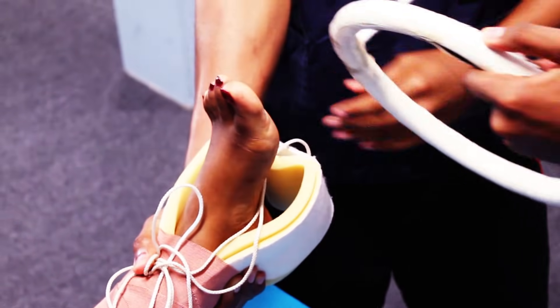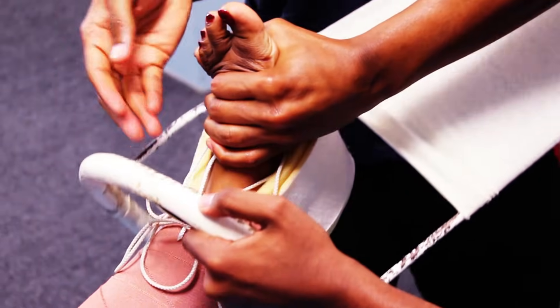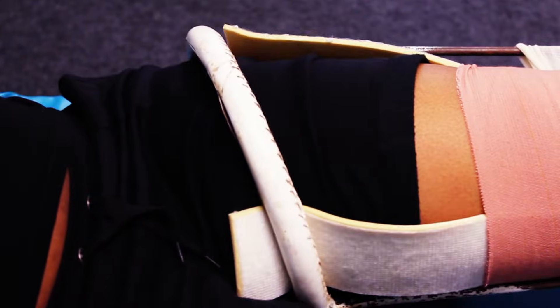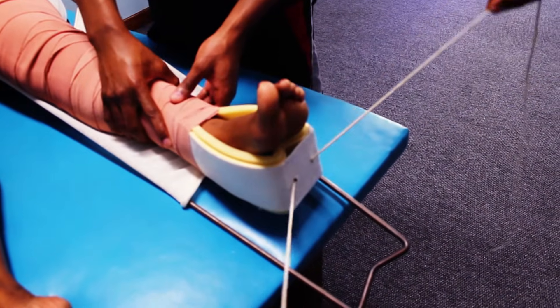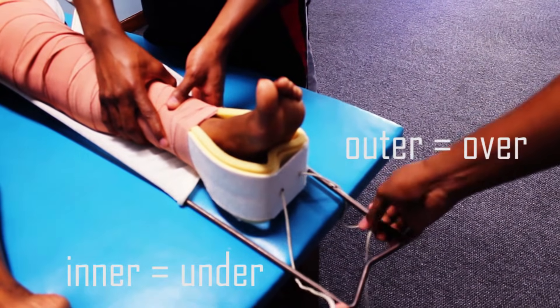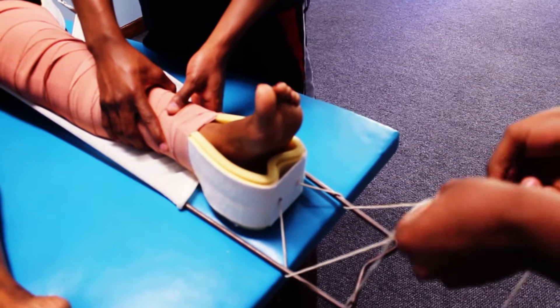With your assistant keeping skin traction, work together to insert the Thomas splint up to the level of the groin. The foot lies in external rotation in femur fractures and we want to reduce it to internal rotation. We can achieve this by putting the inner string under and the outer string over, then tying a reef knot to secure it.